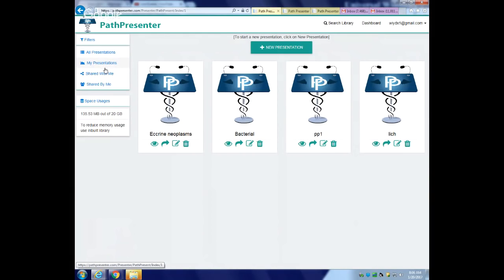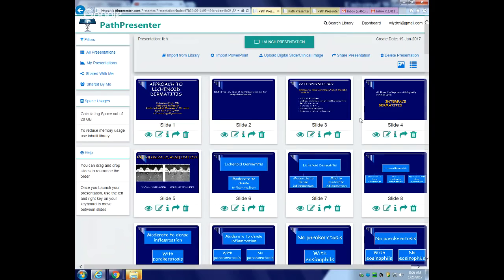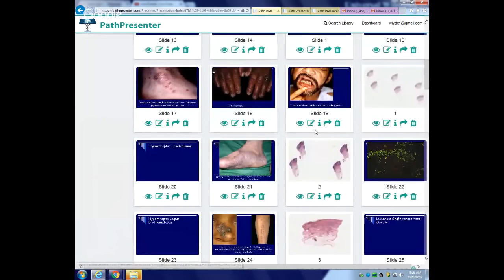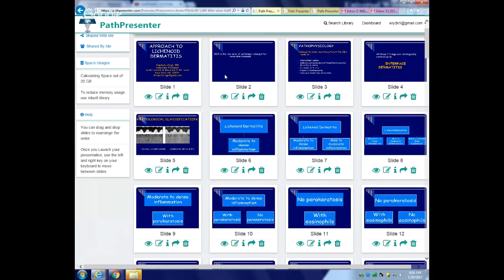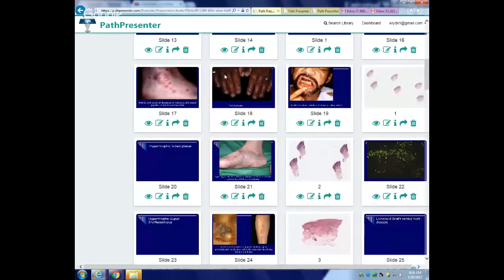Once you make a presentation, how does it look actually? This is the presentation that I made for today. There's a PowerPoint here, and there are additional digital slides. You can drag and drop these slides as you like, to arrange them in the way you would like to present them. Once they're all done, you can then start your presentation. If you want to annotate a slide, you just look at the slide.